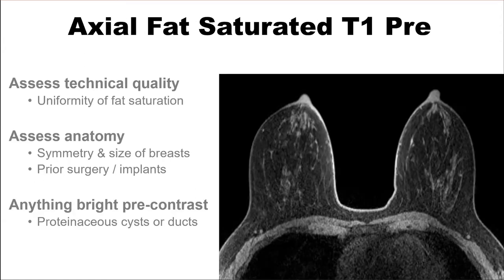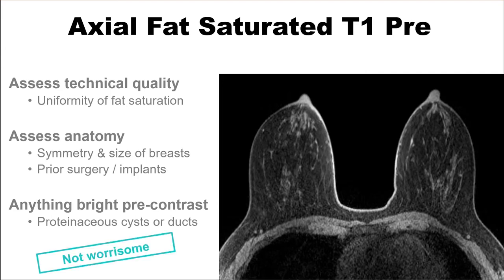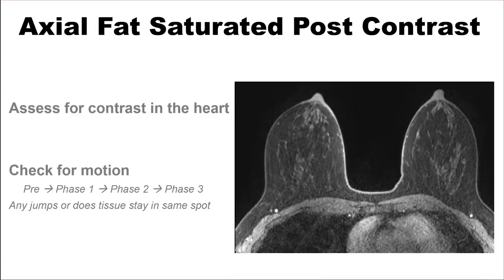Use the axial fat-saturated T1 pre-contrast image to again assess technical quality, looking for uniformity of fat saturation. Next, look at the symmetry and size of the breasts and whether there's any prior surgery or breast implants. And lastly, anything that's bright on the pre-contrast image. This could include proteinaceous cysts or dilated ducts. In general, structures that are bright pre-contrast are not worrisome.